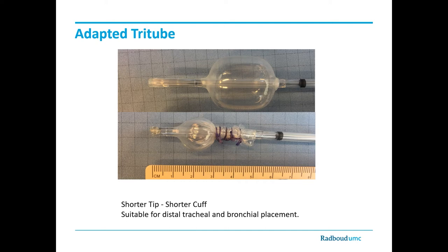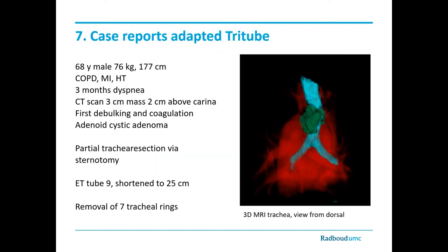After cutting the tip, the edges are smoothed and the internal channel for the filling of the cuff has to be occluded with glue. This must be done at least 1 hour before application to let the glue dry and harden. Now I let you see 2 case reports with adapted Tritube.